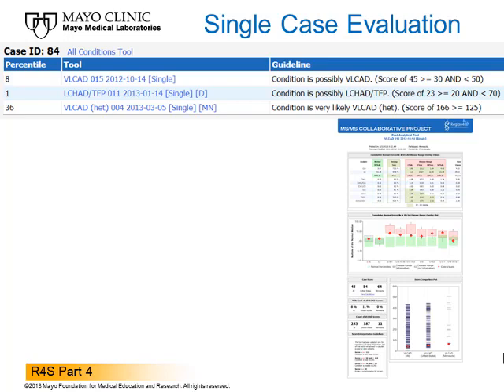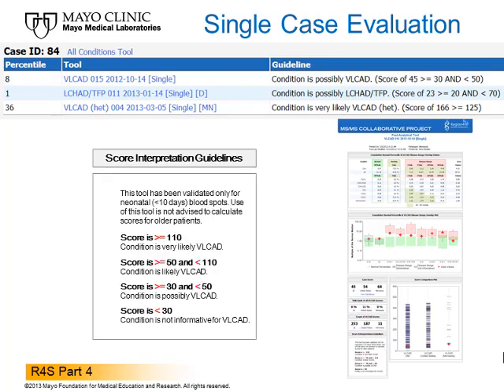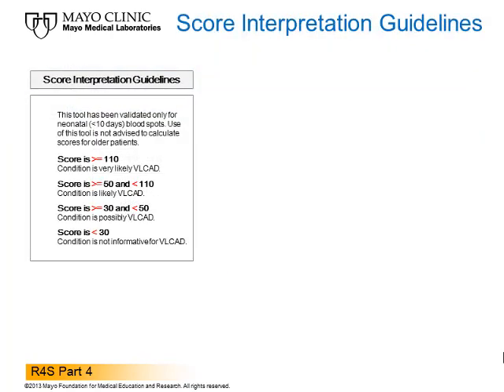The 3 elements that cross over are the actual score, calculated against the entire population of true positive cases, and the percentile rank among those cases. The third element comes from the interpretation guidelines, and that is the interpretation group, score 30 to 50, that includes the calculated score 45. It is worthwhile to show a quick reminder of the methodology used to define the interpretation groups in a consistent and objective manner.